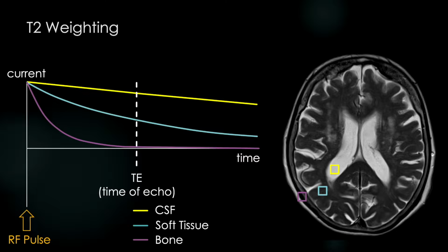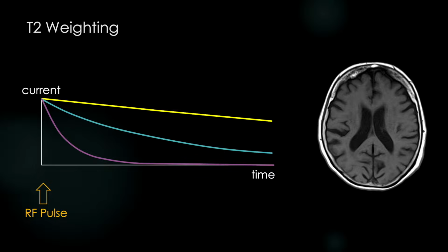In the previous lecture on T2 contrast, we left on a cliffhanger. We described how our time of echo, TE, the point at which we decide to compare all the T2 decay curves coming from each voxel, sets how heavily T2 weighted our image will be. And we hinted that we needed to minimize T2 contrast in a T1 weighted picture, shown on the right. We did this by choosing a short time of echo, the point at which the individual T2 decay curves have yet to significantly deviate and will therefore not contribute large differences between our measurements. So how does T1 play into this picture? Pun intended.